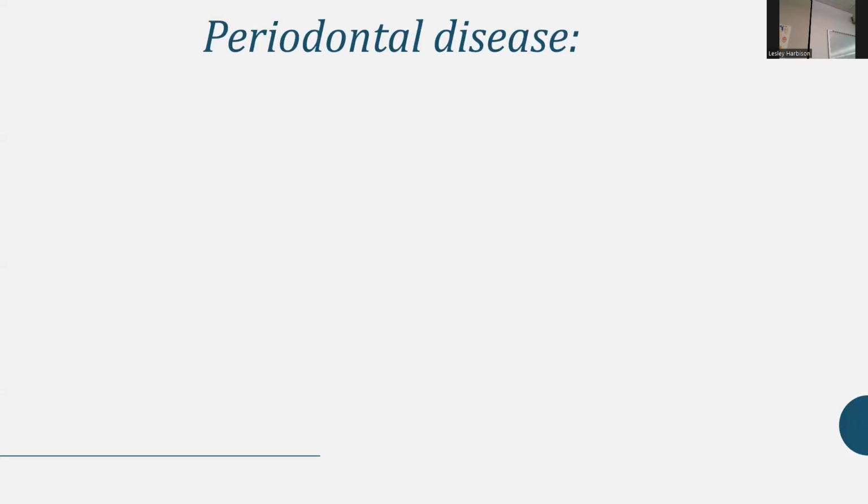But if you look at the width from the CEJ down to the apex, you basically want to cut it into thirds. So you have your coronal third, then your middle third, and then the bottom. It would make a lot more sense if the roots were longer. It's a little cartoonish. But so stage 1 is only going to be less than 15% of that coronal third, and then 15 to 33%, which is the cross hatching, is going to be the level of stage 2.